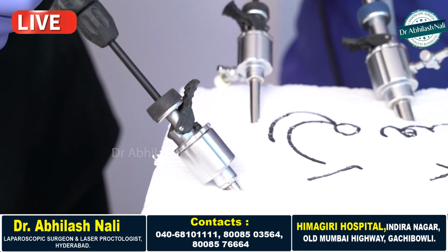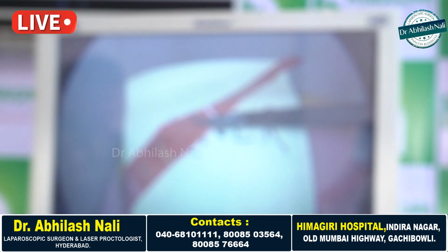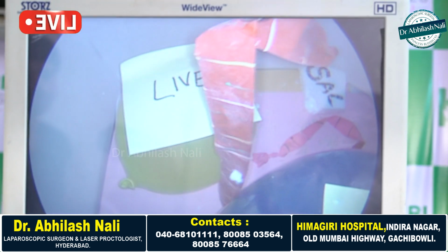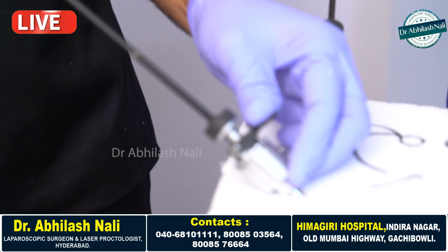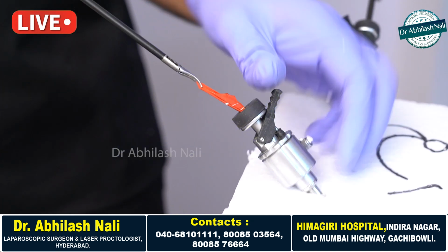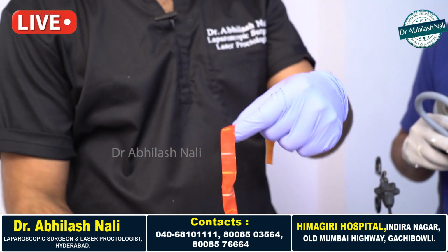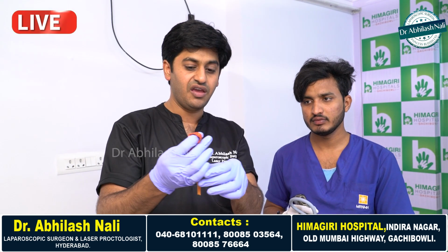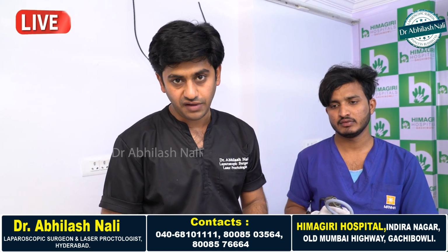In the same way, if there is a worm in the abdomen and we want to remove it, instead of cutting open, we can catch it with laparoscopy and remove it from inside, as demonstrated. So without cutting, we are able to remove the complete worm in this way. Through these small holes only, we can even remove such long worms, and this is the beauty of laparoscopy.